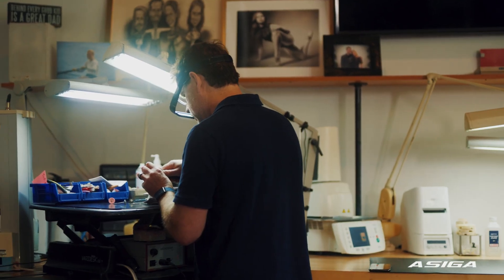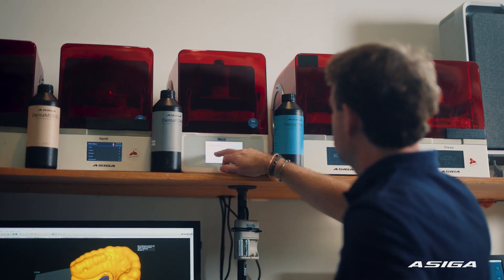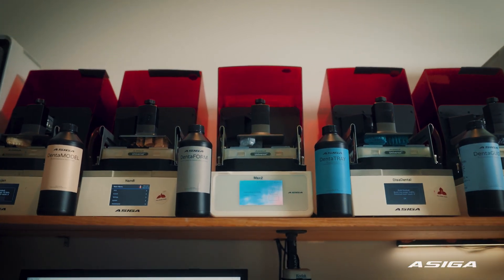I thought, let me buy the biggest printer there is because that's going to give me the edge. My good friend Amin, who owns a dental lab, said he'd found the printer. I walked into his lab and in my mind I'm thinking, what a little printer that is. Man, I was so wrong about it. I just couldn't believe the quality coming back — and that's where I committed to my first Asiga Max. I've never looked back since then.